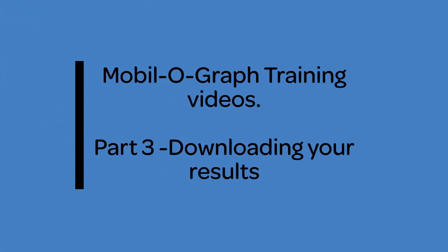Welcome to part 3 of the new Mobil-O-Graph training videos. This video will guide you through downloading results from the device after being returned from a patient.